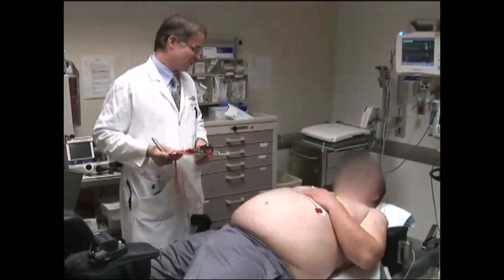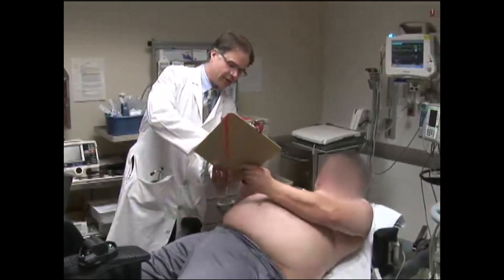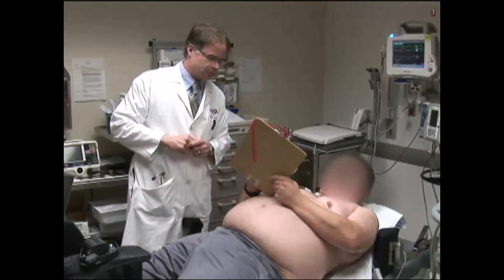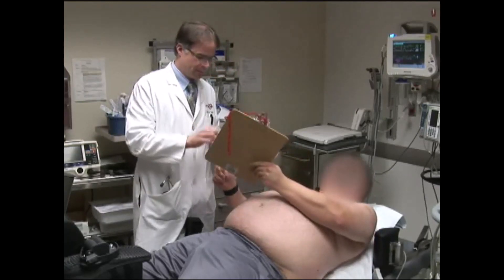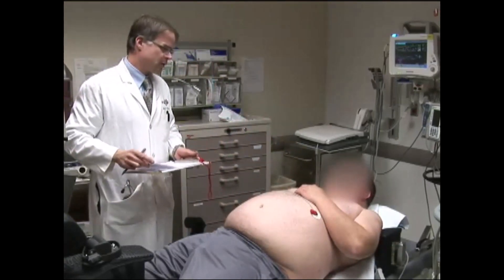Before beginning the procedure, the indications for the study are reviewed, along with relevant clinical history such as prior cardiac surgical procedures or presence of an ICD. A focused physical examination is performed. After a discussion about the risks and benefits of this stress test, informed written consent is obtained.